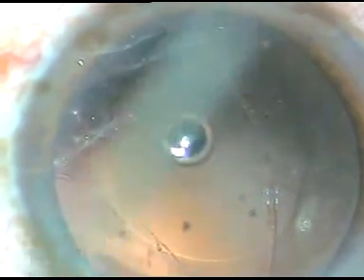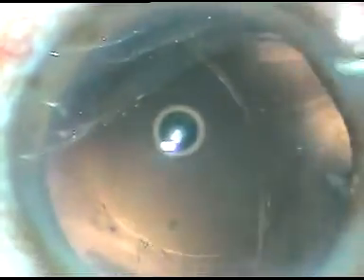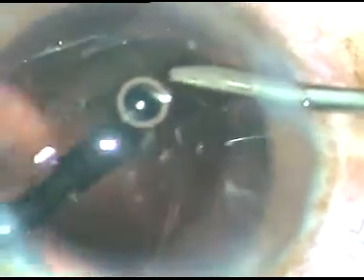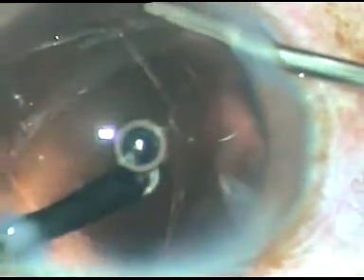I have asked for the cutter again and I am going into the anterior vitreous. The irrigation is through the right side port and the cutter has gone into the anterior vitreous. That cortex came out and was removed. So many times we can remove the cortex if we go into the anterior vitreous. Now, I am trimming the posterior capsule.